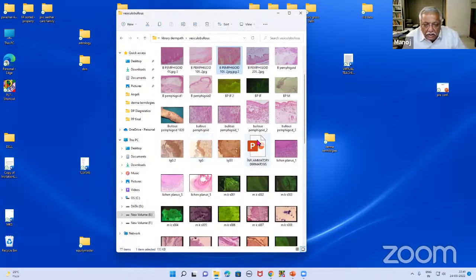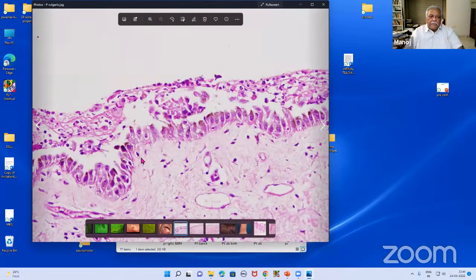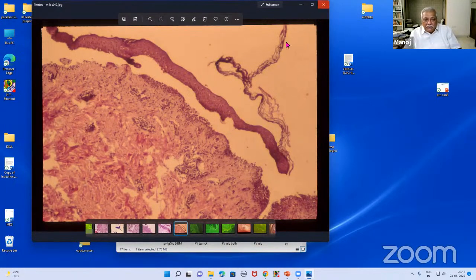Okay? On the other hand, what we had seen about this one. Okay? So this is suprabasal because this is the basal layer, right? Basal layer that I had shown you. This is the basal layer and it is attached to the basement membrane, because the attachment of those cells to the basement membrane is different from the normal desmosomal. So desmosomal junctions are gone, but this is attached. So the basal layer remains with the lower part, everything else goes up. This is suprabasal. Is that clear? I think that is perfect. Yes, sir. Again, not a good photo.